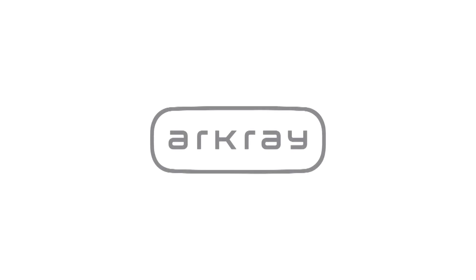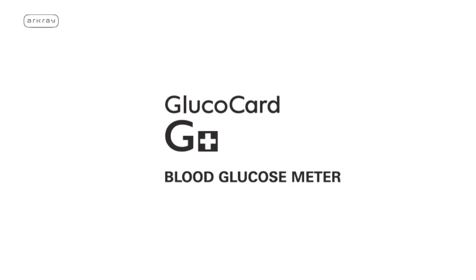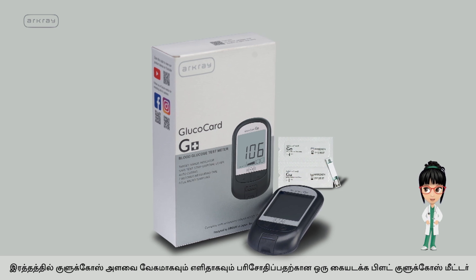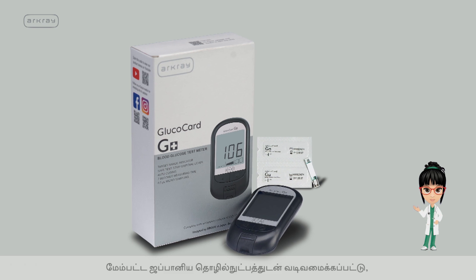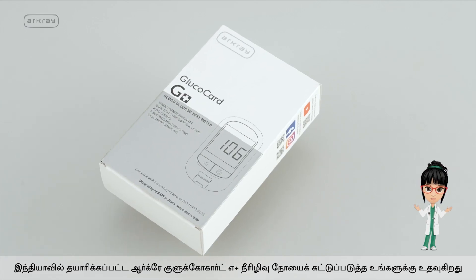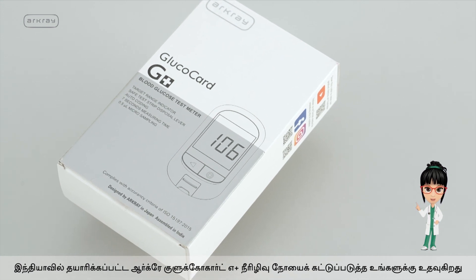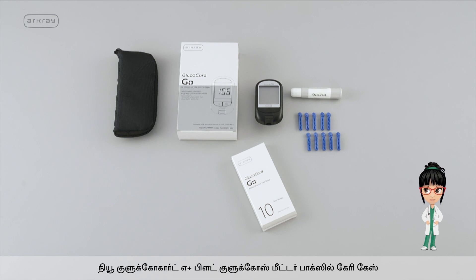R-Cray, one of Japan's leading diagnostic companies, brings to you R-Cray Glucocard G Plus Blood Glucose Meter. A compact blood glucose meter for faster and easier blood glucose testing, designed with advanced Japanese technology and manufactured in India. R-Cray Glucocard G Plus enables you to manage diabetes with ease.